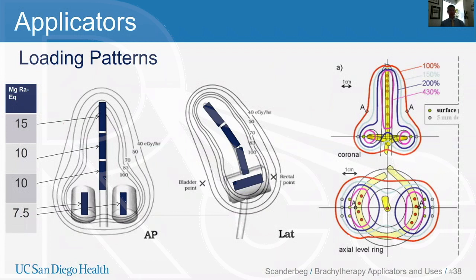So, loading patterns. There are a variety of methods to load a given applicator, and we'll focus on the one given in your handouts and what they've been teaching. I think Derek will go over cylinders next week, then tandem and ovoids, and I'll follow up the following week with tandem and ring.